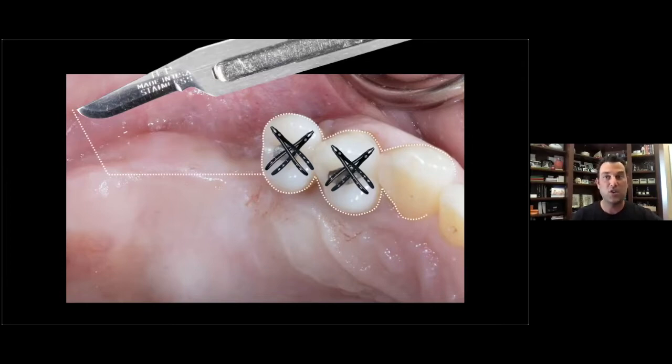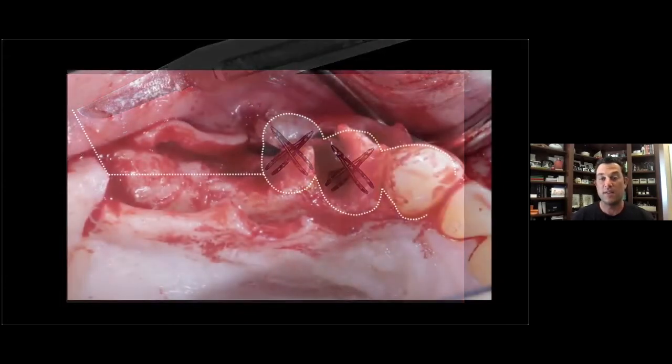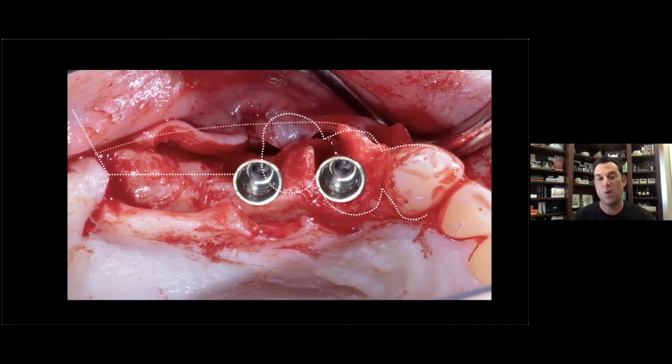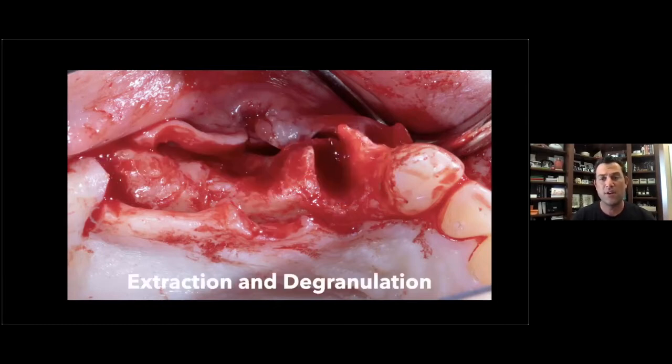The treatment plan was to extract the two teeth. I love placing a distal buccal releasing incision for plenty of access and ability to coronally reposition the flaps. You can see the extent of bone and tissue loss — these teeth were in secondary occlusal trauma for a long time. Teeth with predisposition for periodontal disease have a reduced periodontium, and those normal occlusal forces put so much pressure that the teeth are under fremitus and being pushed buccally. You can see where the teeth were versus where I want my implants based on the preoperative wax-up.